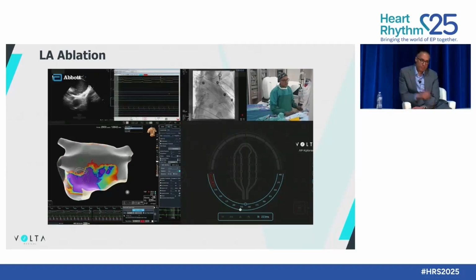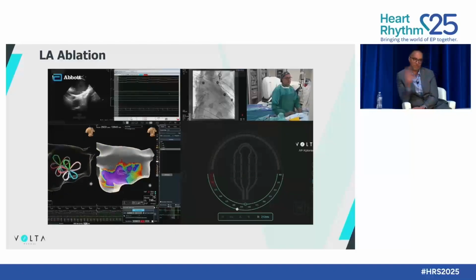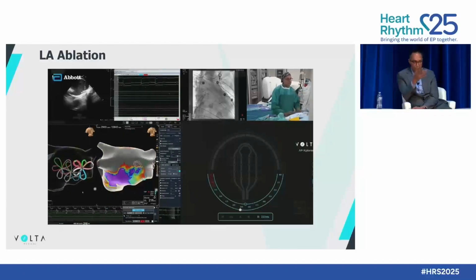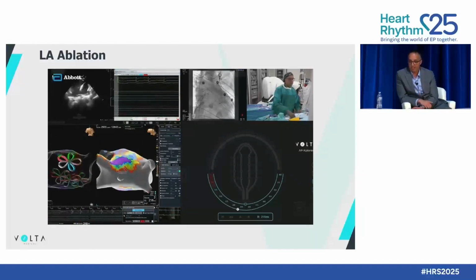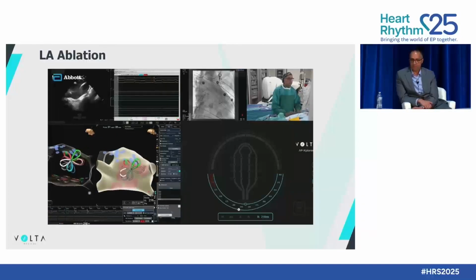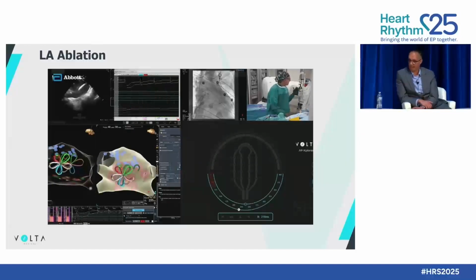So what was my ablation strategy based on this? You can see that, again, and I will say I probably should have done a better job of completely mapping all of the chamber, but it is important, as Jerome comments on, meticulous. You have to be meticulous about mapping and find these areas of dispersion. So now that we have a catheter that can just deliver scorched earth to the atrium, should we, or maybe we should be a little bit more elegant about how we do this.